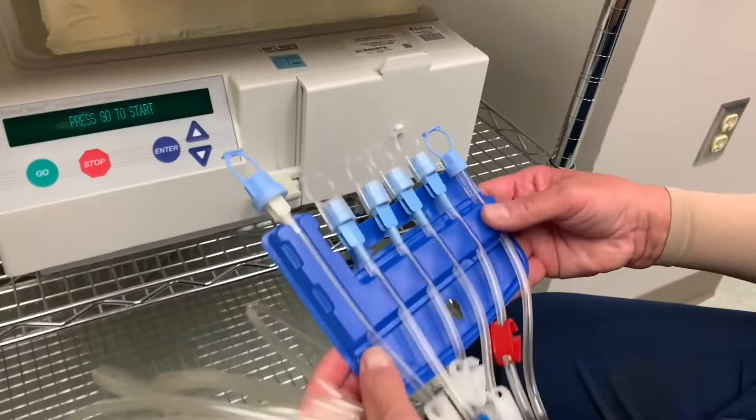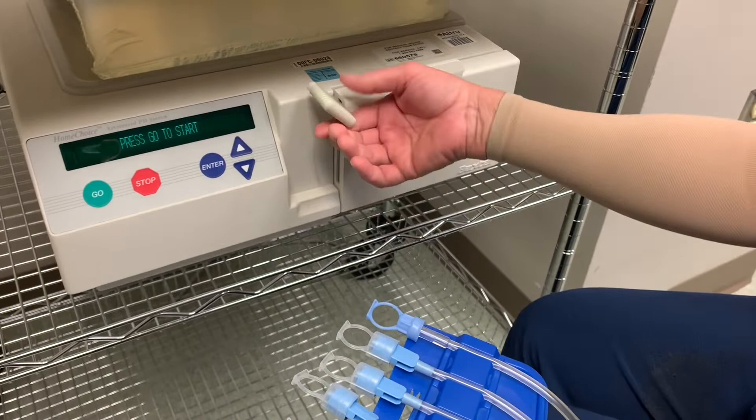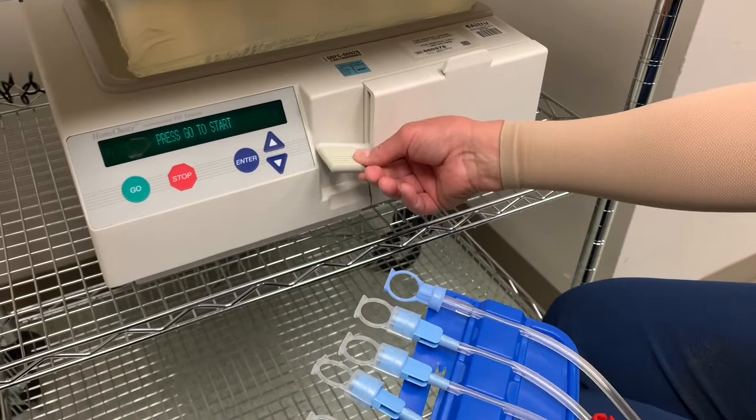The blue thing is the patient organizer — it holds the lines. Sometimes they fall out easily, so just put them back in. Do not ever force this open. You should press Go and be able to hear the machine respond.